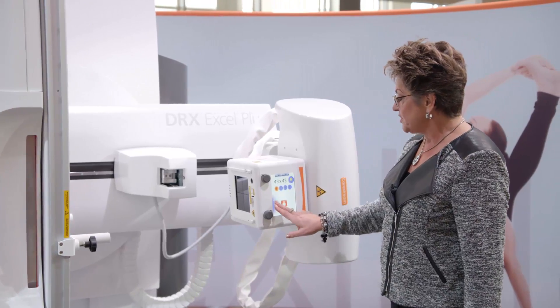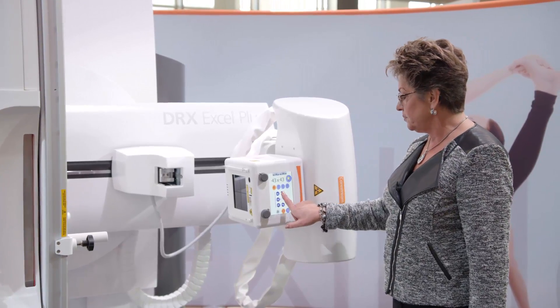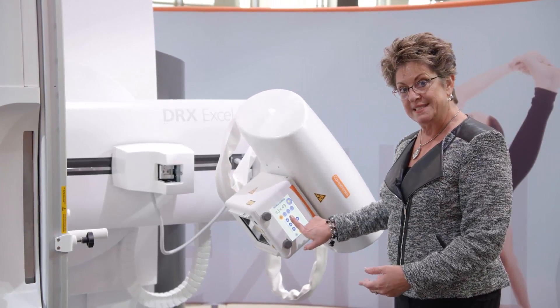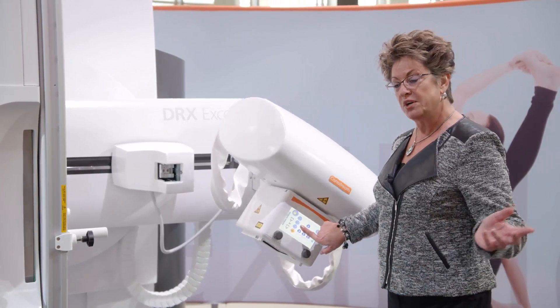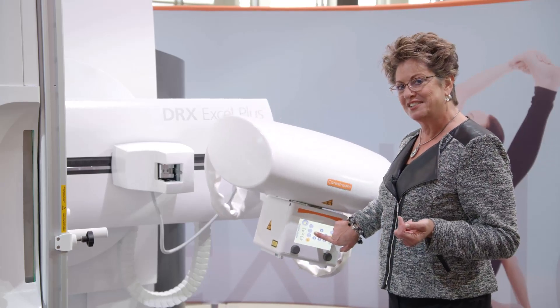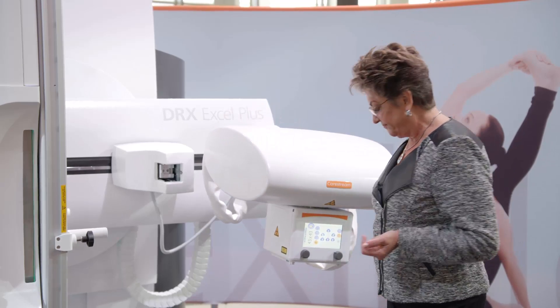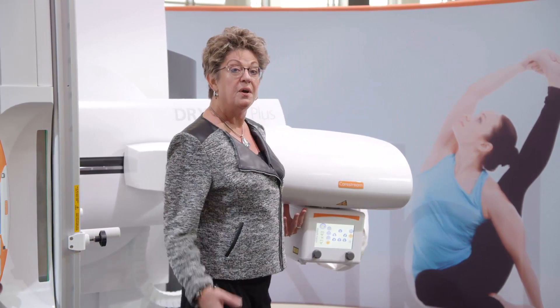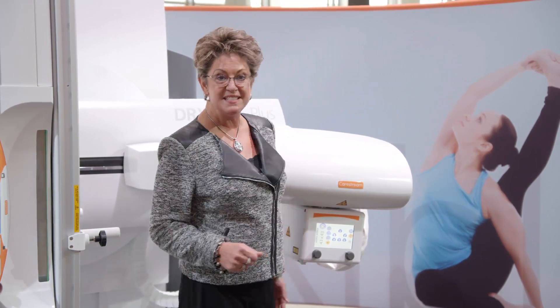But I do have the option to also control the tube independently. So if, for example, I wanted to do a standing AP foot, I could bring in a DRX1 detector from another modality and angle the tube in this direction and potentially do my standing AP feet in the same room.